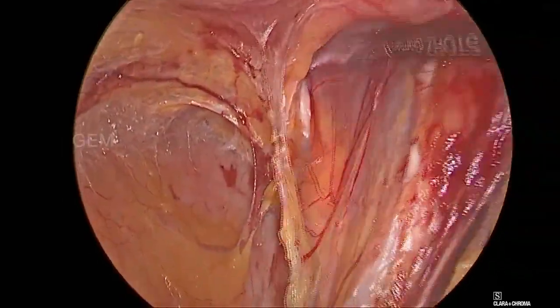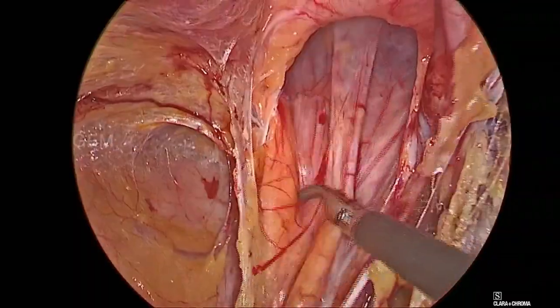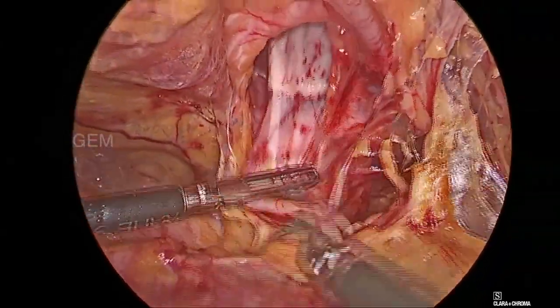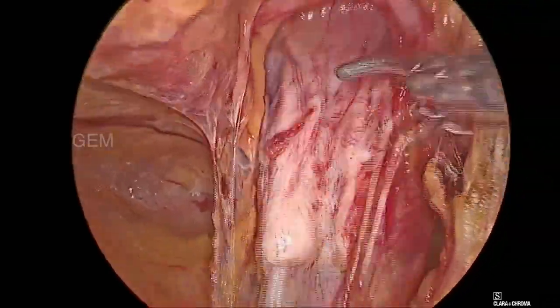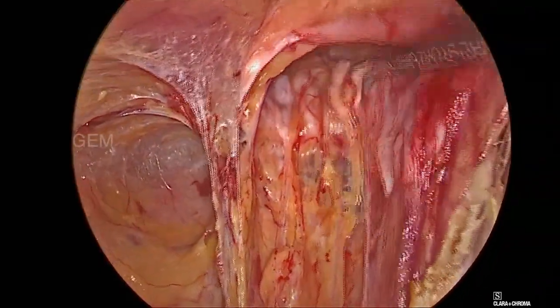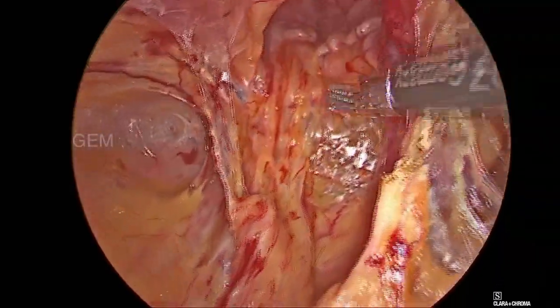We are reducing the pseudo-sac. This is a long-standing hernia so the sac is thick and chronic. The sac has almost completely been reduced.